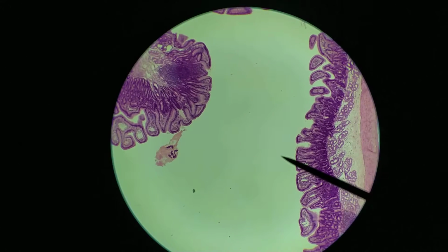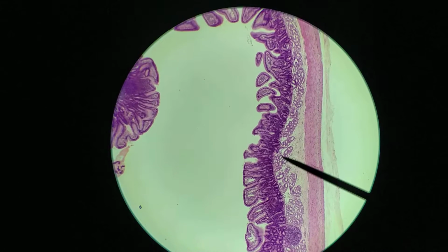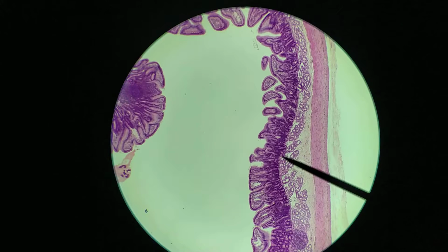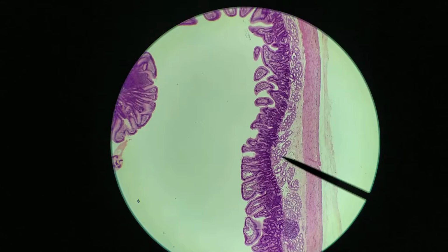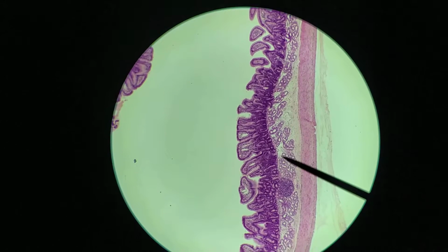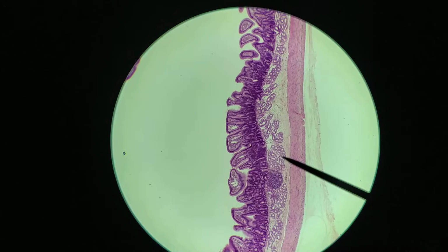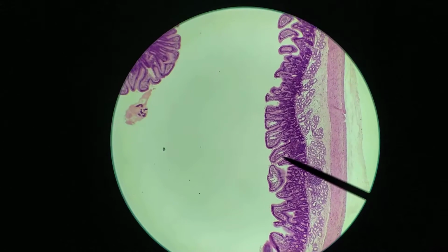Okay. Now, the reason that I can tell that this is the duodenum is that right here in the submucosa, I see lots of glands. This is the submucosa. From here to here, submucosa, and I can see lots of submucosal glands. Okay. You're only going to be seeing that in the duodenum because these glands are producing a lot of mucus, which is going to be alkaline, which is going to help to neutralize stomach acids.